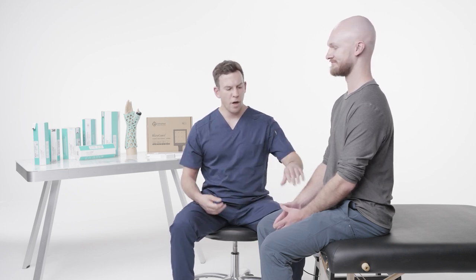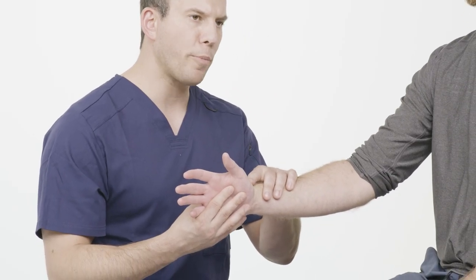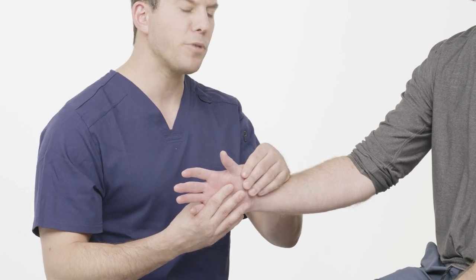I'm Dr. James Stavis with OrthoHeal, and I'm going to show you the Thumb Spica Immobilizer. Thumb Spica Immobilizers are typically used for scaphoid fractures, any kind of carpal-metacarpal issues, or any kind of thumb sprain.